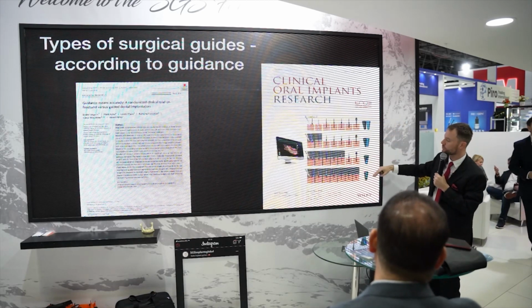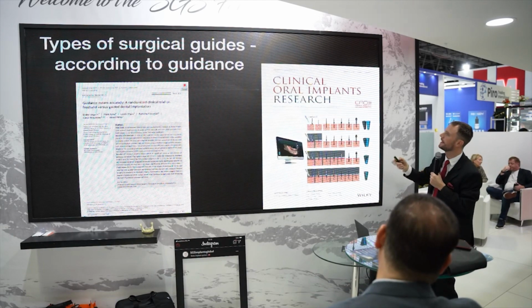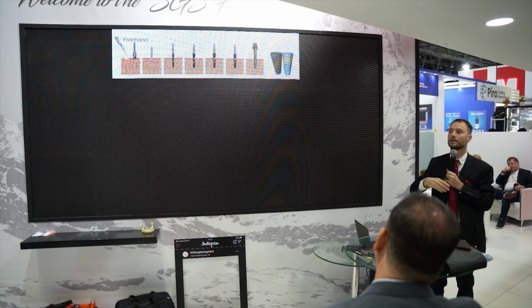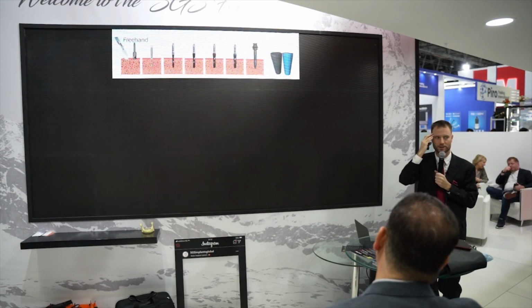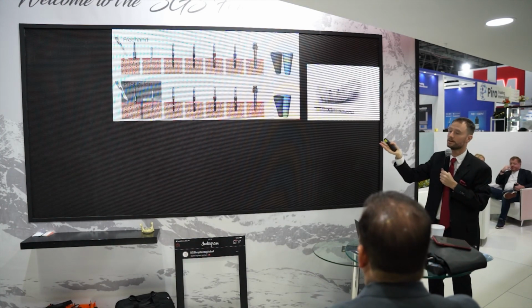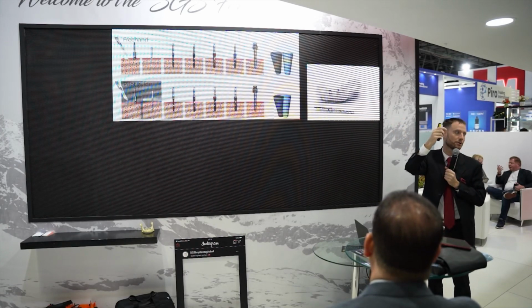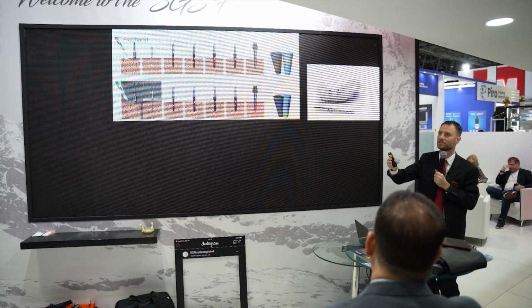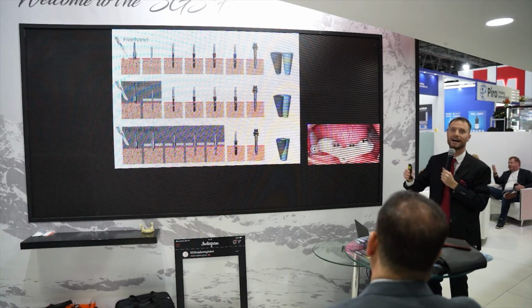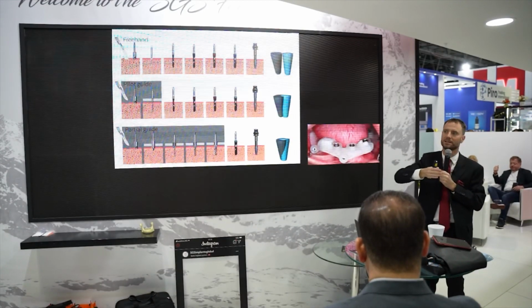We had our own research where we compared the different ways of implant planning. We had 4 ways. The first was freehand: I showed you, see the CT, figure out what you want to do with the implant by mental navigation. Or we do a pilot, that means we do a planning, we have a guide, but that's only for the 2mm drill, and everything else I do freehand. Option number 3, I have a guide, I do the bony housing until approximately the diameter of the implant.